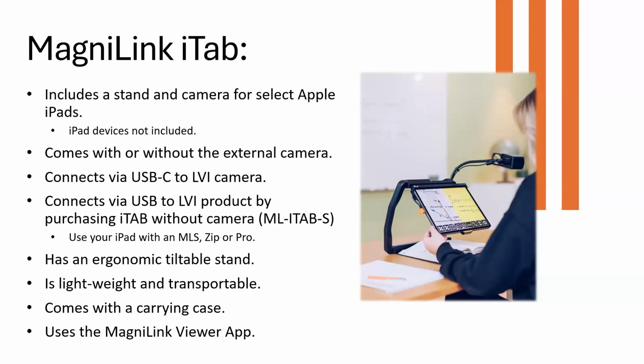And when you buy an iPad, you get, I think, usually about a 20-25 watt charger, and we know that's not going to be powerful enough to charge the unit while you're using it. So if you decide to buy just the stand because you have an S, a Zip, or a Pro, we also give you a very powerful charging cord with it. I believe it's 55, 60 watts. That allows you to use the product and charge it at the same time, and gives you full product use. So there are a lot of beauties to that stand.